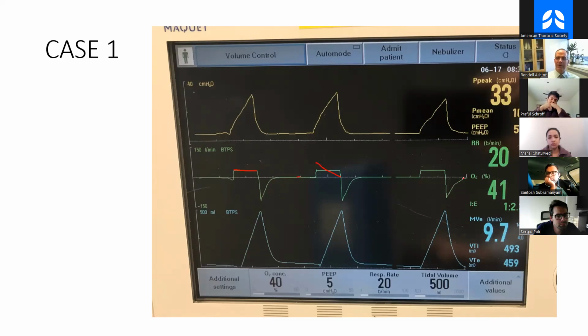Here's a nice one over here. See that, how it just decreases in that nice curve? So that's what a pressure control flow looks like. Remember that exhalation is nearly always pressure control. So if you ever see a curve that looks like this, but flipped up on top of the line, so if you look up here and you see a curve that looks like this, you know that this is a pressure control mode because this is following the same pattern as pressure control exhalation.